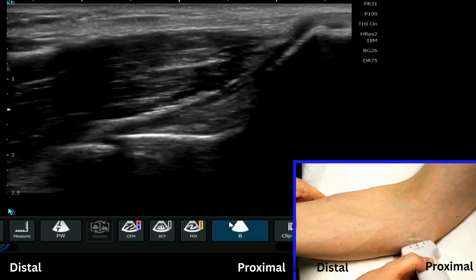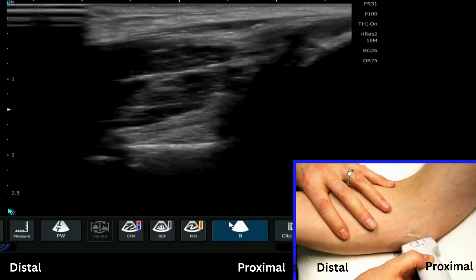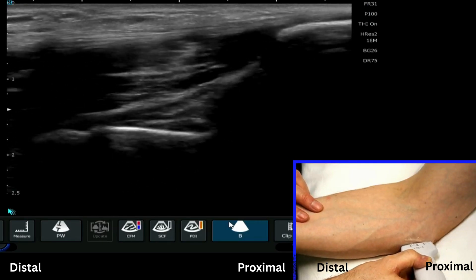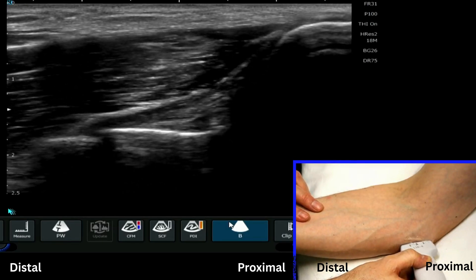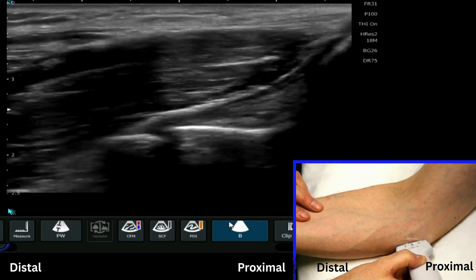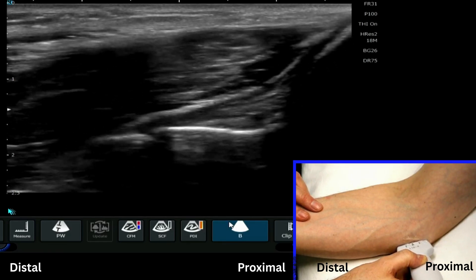I'm going to apply a slight valgus stress on the elbow joint so we can really test the integrity of the ulnar collateral ligament in that position. We can see it really nicely just by tilting the distal aspect of the probe down, to give a slightly nicer, crisper image of this ligament.